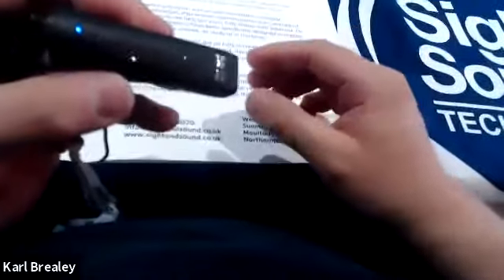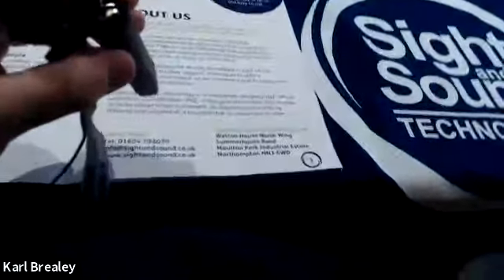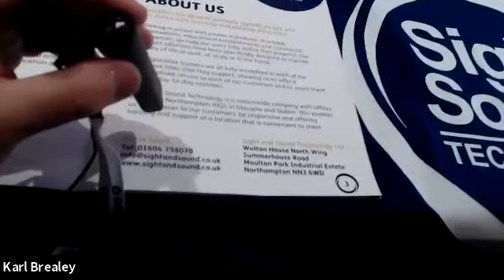Right, I'm just going to stop that a second. To stop the text as well, you just tap the side, exactly the same place. Or what I will show you in a second, when I've got my glasses on, I'll go through and quickly put it on the other camera just for a second.